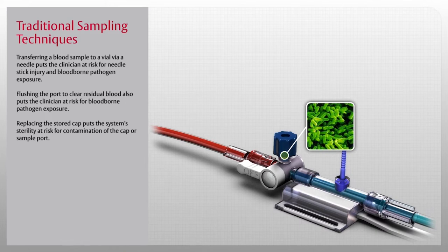Replacing the stored cap puts the system's sterility at risk for contamination of the cap or sample port.